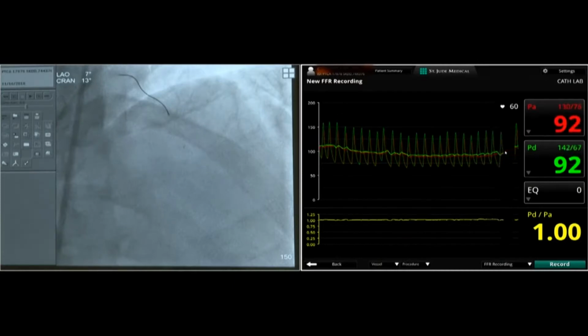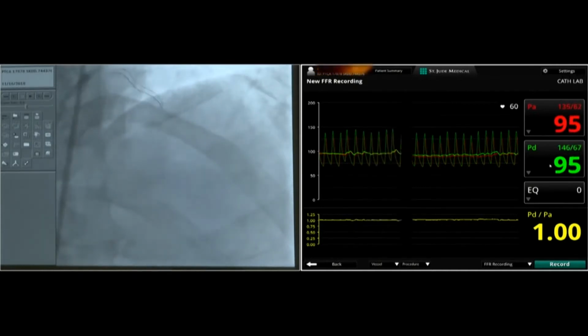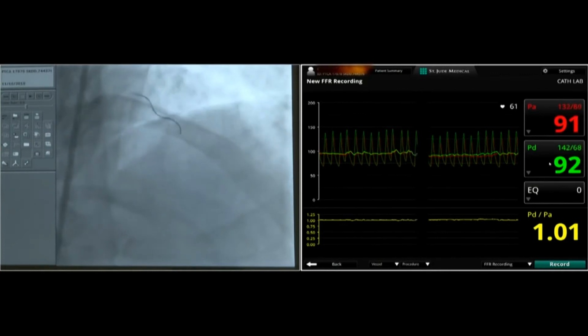Exactly. And actually take into consideration in a live case, when the wire is getting damaged in a recently placed scaffold, there's more trauma that probably will happen to the vessel trying to repeatedly attempt. Yeah, no, I think it's a very reasonable point.